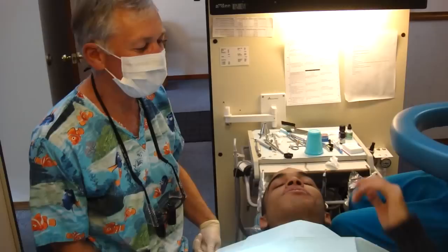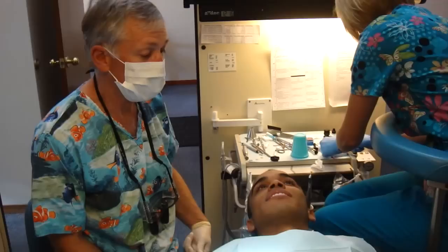Great. I'm just going to check your bite, and then you'll be ready to go. I've had those last for patients over 20 years. I still have my first ones I ever did — the guy still has them, so they should last a long time for you. Thank you so much. You're welcome.